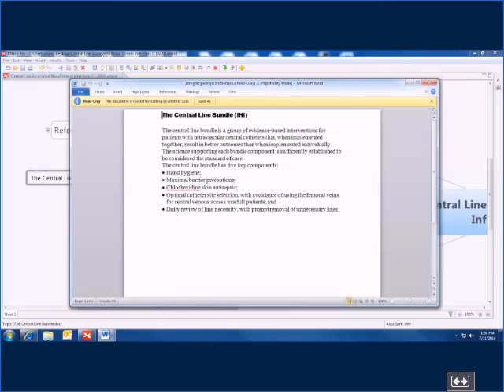Everybody who deals with and puts in a central line has to understand the importance of hand hygiene and aseptic technique, not only in placing the line, but in using the line and managing the line. Everybody has to understand maximal barrier precautions, i.e. when you put the line in using very sterile technique with enough help where you have a free hand to make sure that we're not inadvertently contaminating the site or the line. And then when the line is inserted aseptically, a barrier goes over the puncture site that doesn't allow it to be contaminated.